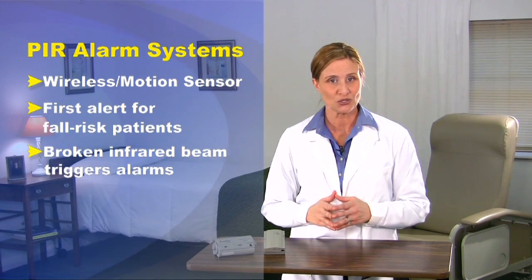This presentation takes a closer look at System 2 and explains the benefits specific to the system, its components, setup instructions, and how to use it.